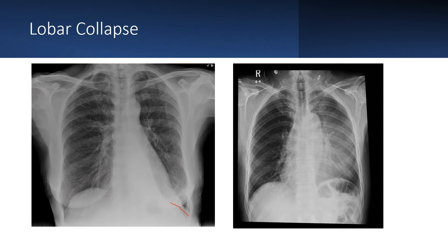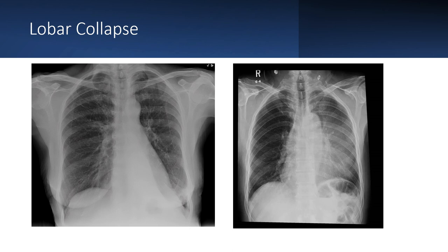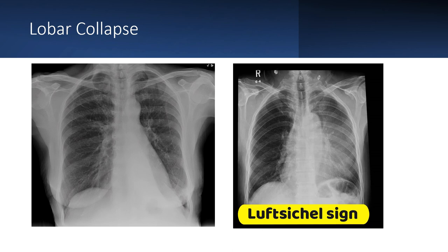If the question asks what is the next best investigation for left lower lobe collapse, the answer is bronchoscopy — which will give more information than a CT scan, even though the patient will eventually have a CT. In another chest X-ray, you can appreciate a homogeneous opacity on the left side, but the left hemidiaphragm is clearly delineated and the aortic knuckle is visible with a rim of air surrounding it. This is known as the Luftsichel sign and is classical of left upper lobe collapse.